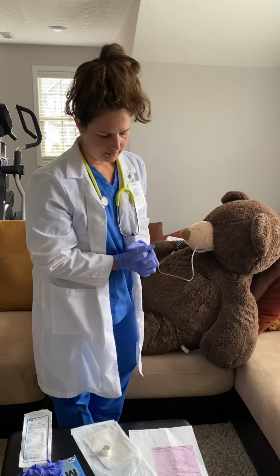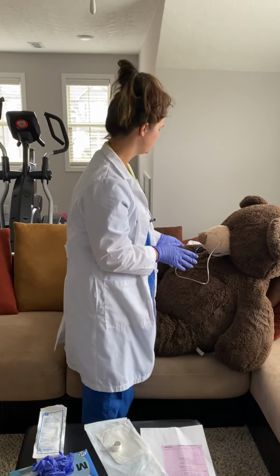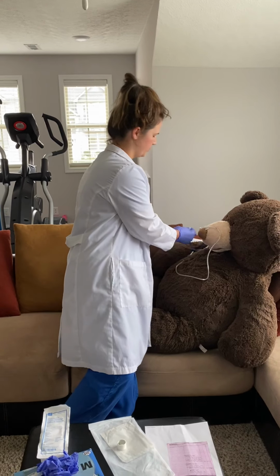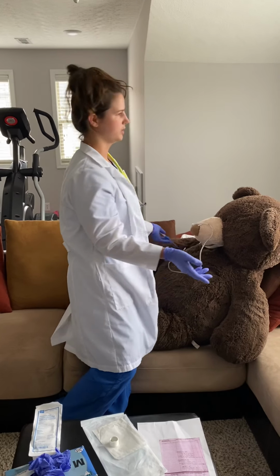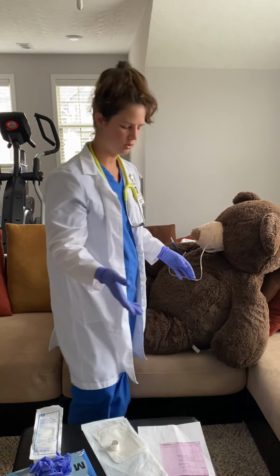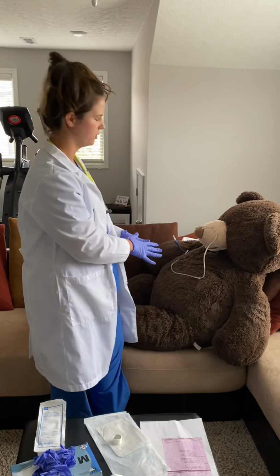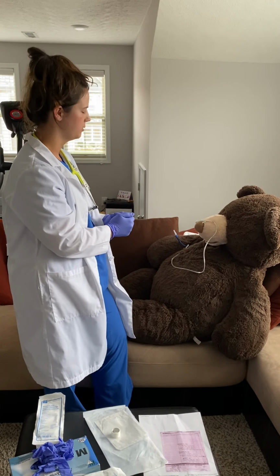All right, and then next we're going to be doing lavage on this patient. And I just want to note, you want to always confirm the surgeon's preference on whether they want this airway open or if they want it plugged. Some of them have a preference of keeping it open for air. So just make sure you confirm with your surgeon on that. So for lavage, again, you want to make sure you do an abdominal assessment prior, and then place them up into the high Fowler's position.